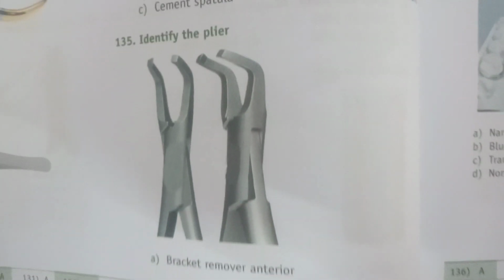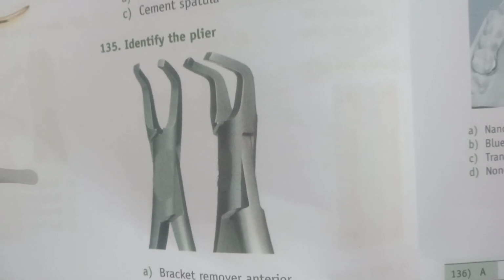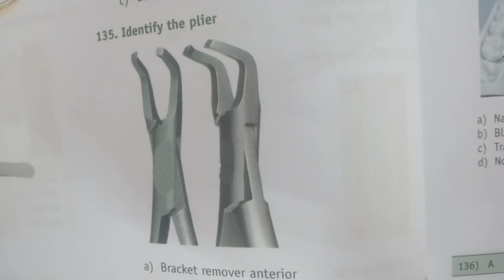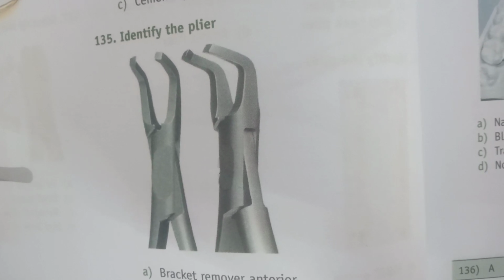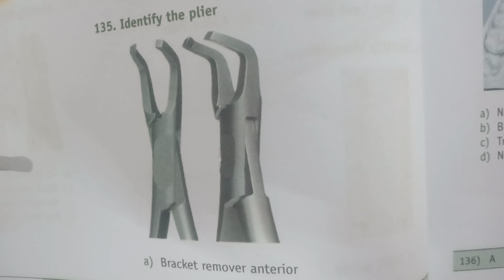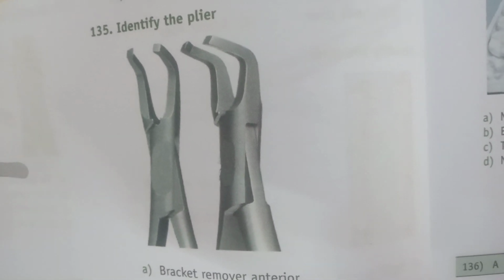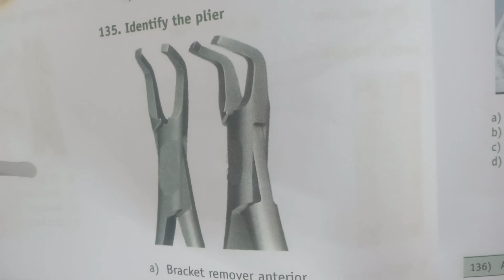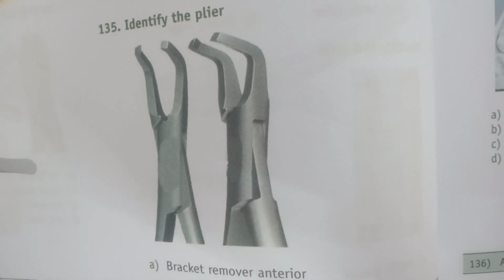Next, identify the plier. Is it bracket remover anterior, bracket remover posterior, bracket placer anterior, bracket placer posterior? So the answer is bracket remover posterior.